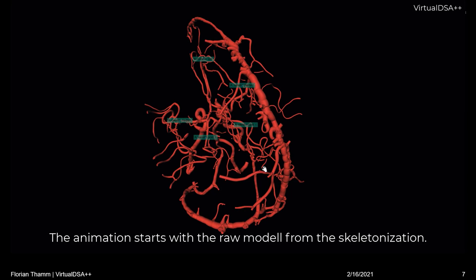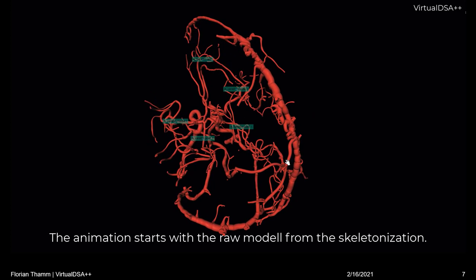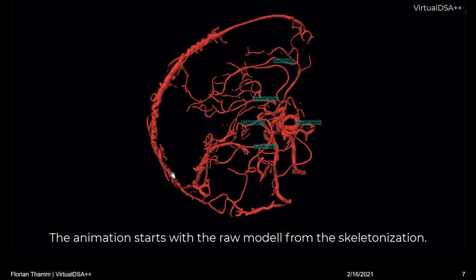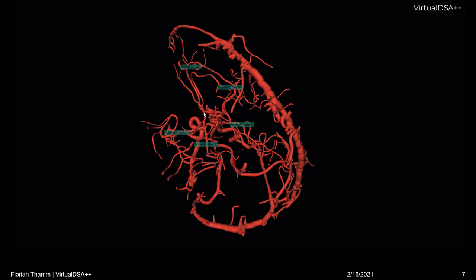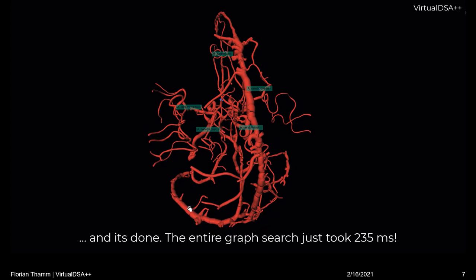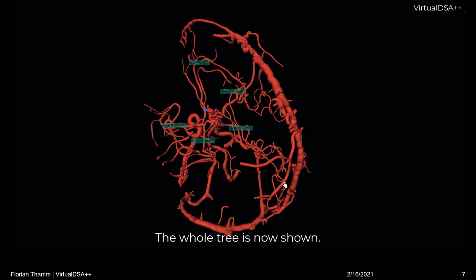Everything you will see now was computed on an ordinary CPU, and the subject is basically more or less healthy, with no large vessel occlusions. The demonstration starts with the output of the skeletonization — I will clarify later what that means. First, the root node is being set by the user, and the graph search is initiated, which is quick. It only took 235 milliseconds to compute all the shortest pathways.